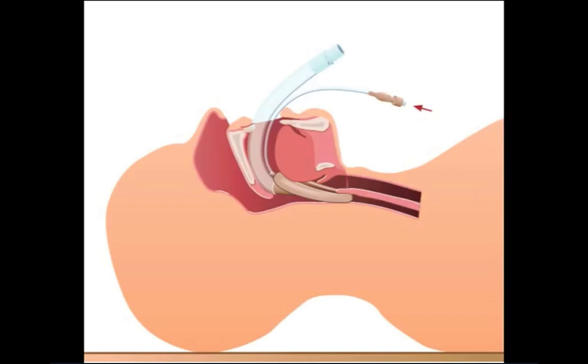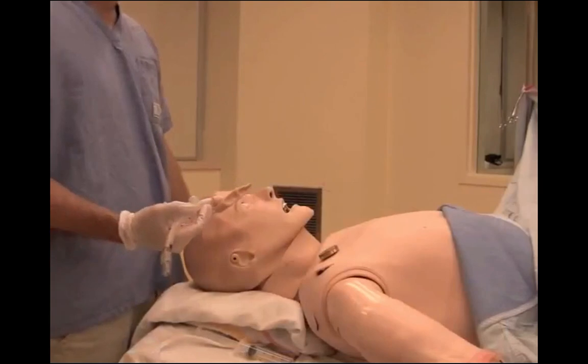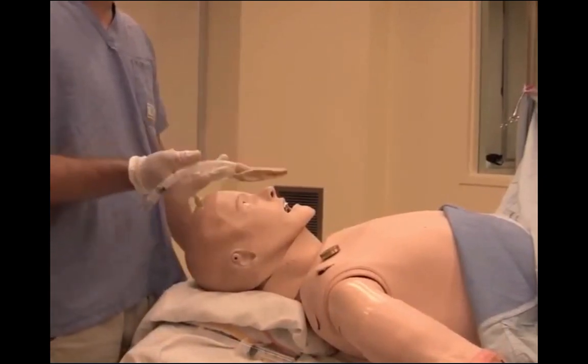Over the years, clinicians have developed many personal modifications of the classic LMA insertion technique. These include partial inflation of the cuff prior to insertion, a 180-degree rotation of the cuff during insertion, and techniques which avoid placing the operator's fingers in the patient's mouth. We'll next demonstrate the insertion of a classic LMA.